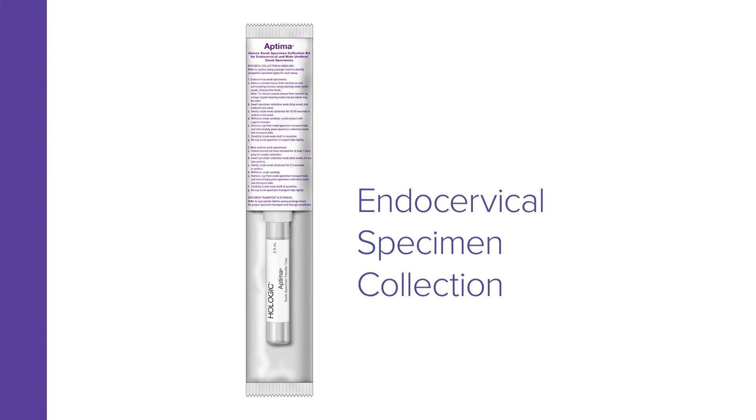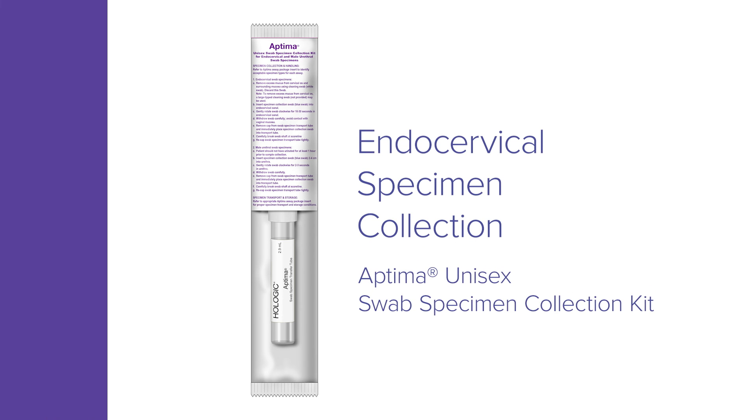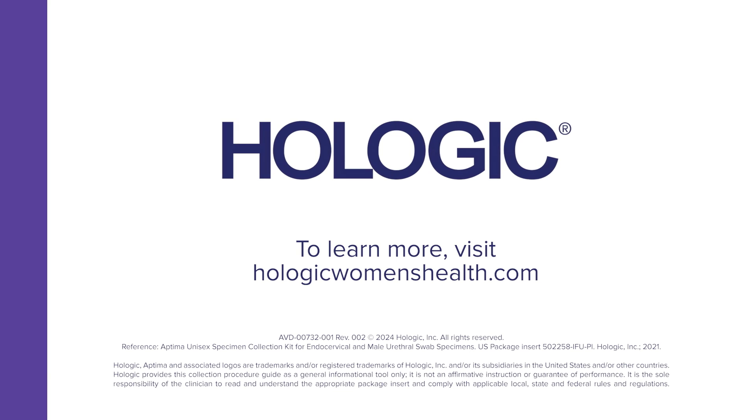Endocervical specimen collection by clinicians with the Aptima Unisex Swab Specimen Collection Kit. To learn more, visit HologicWomensHealth.com.